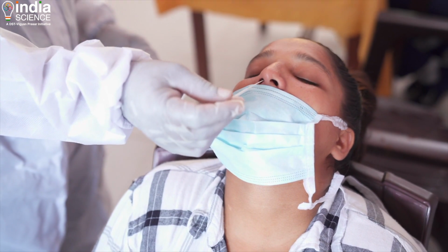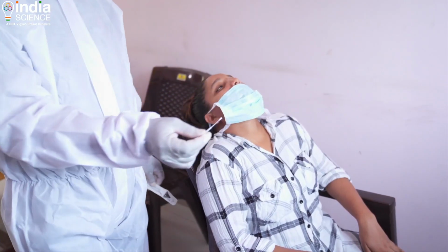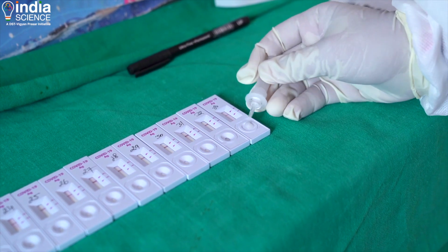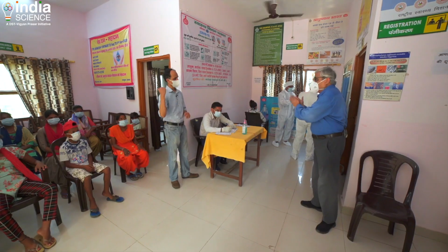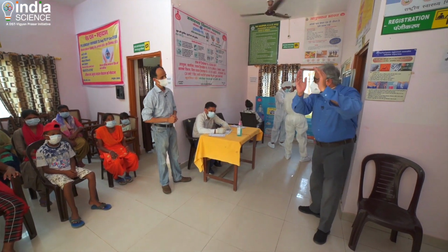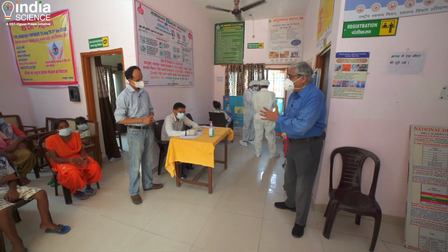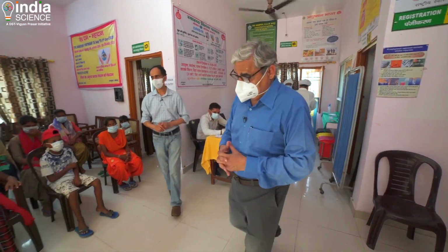Yes. And they will do an antigen test here, which is a rapid antigen test. And a person who turns out to be negative but has symptoms, will their sample be tested? The sample will be taken to the mobile lab, where you will do your confirmatory RT-PCR test. Yes. Let's go there. Okay.